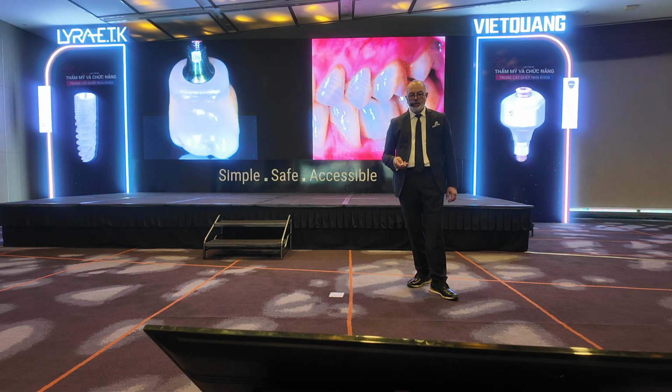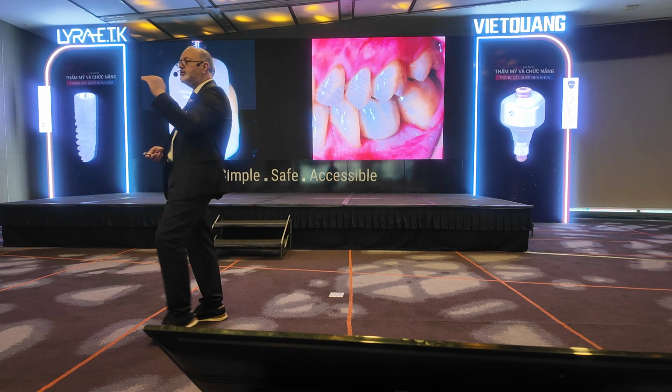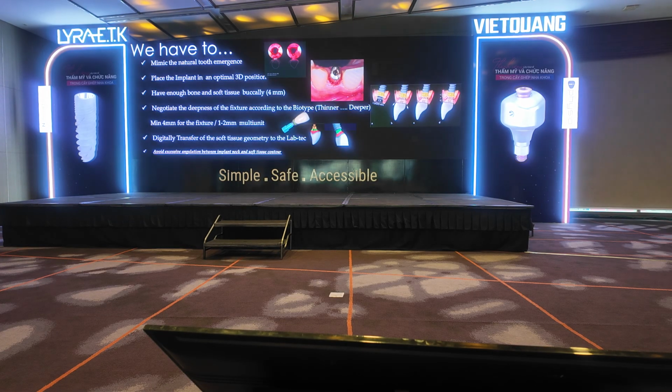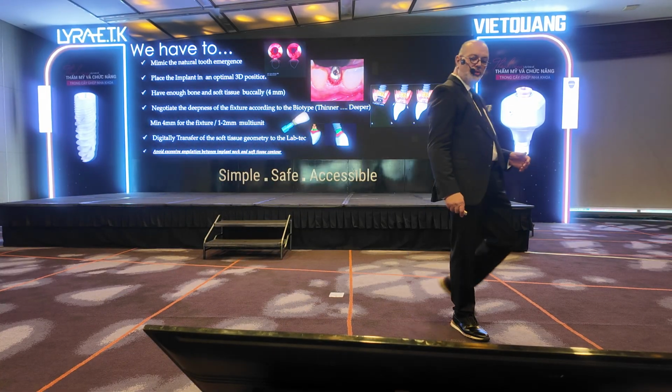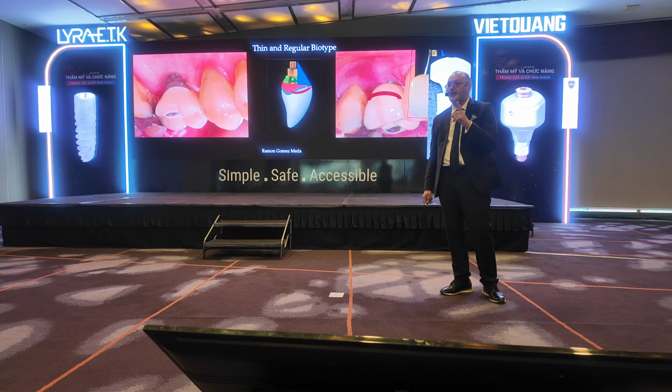But this is how it looks and how we have the final restoration, really stable, because the upper part of the keratinized tissue is not under pressure. The pressure is down. Down you can press whatever you want laterally. Up, no. You press, you can take a photo in the beginning, but with time, this tissue will go and reach the lower part. And this brought me to the last part, which is this emergence angle.